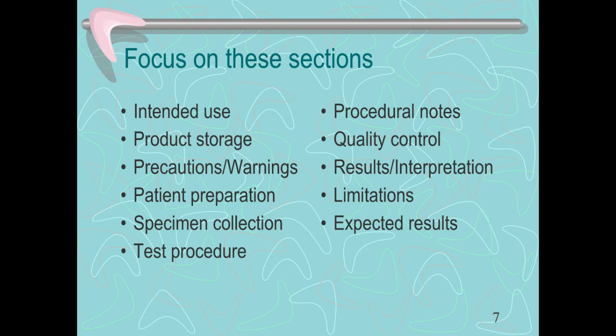Quality control. So sometimes you're going to be using machines to run some of these tests. Sometimes you'll have a urinalysis machine that's CLIA waived as opposed to the dipstick. You have to run quality control on those every so often. Finger stick blood sugar. There's specific quality control that you have to document, how often you've done the controls on that. So be sure that you're keeping those records.